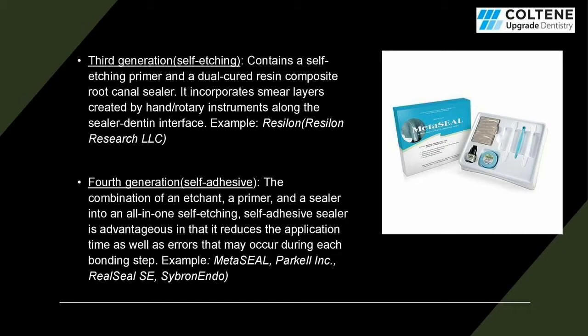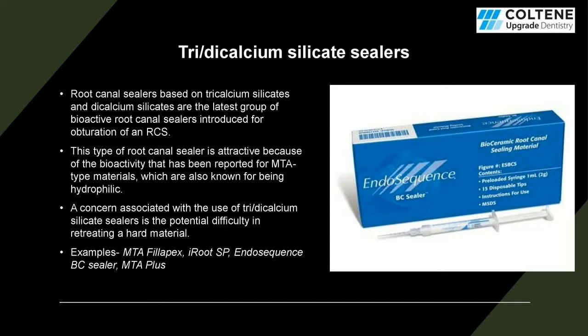So now we come on to the tricalcium and dicalcium silicate sealers, the ones that we talk about more often than other root canal sealers. It is because it exhibits a significant improvement in biocompatibility over other sealers. Nevertheless, it is a very good obturating material, but one very difficult thing that we have is its manipulation and its setting time. It's very long.